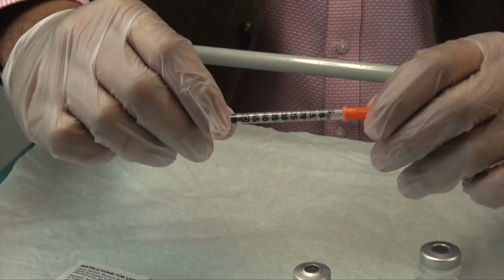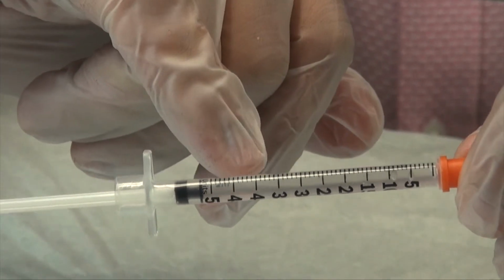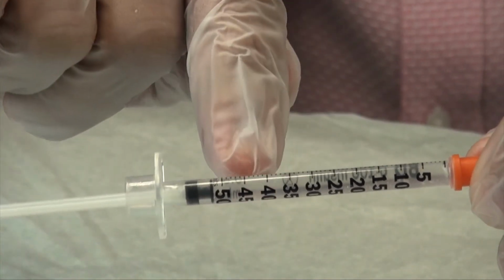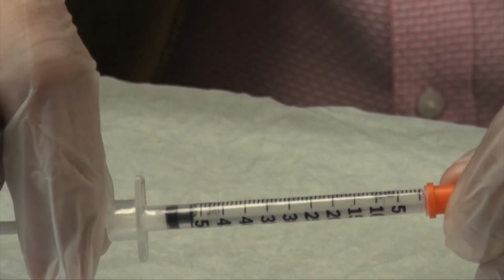Much the same as the Allergan Botox, this gives us, when we withdraw 0.5 mils of the solution, another 20 units of Bocouture in this syringe. So going as we did before, we have 2 units per 0.05 mils. So this, if we were to count down the graduations, has 2, 4, 6, 8, 10, 12, 14, 16, 18, 20 units of Bocouture.